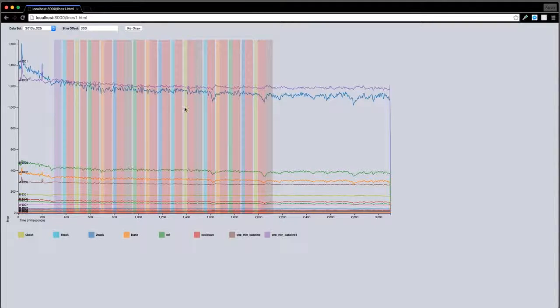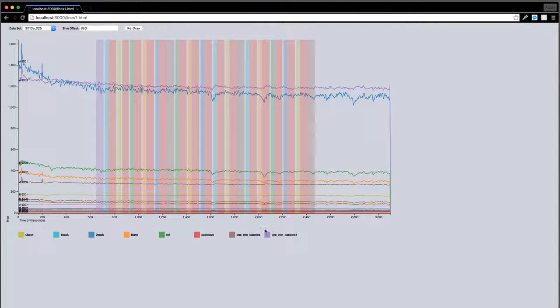And what that allows the user to do is, based on their own information, sync up the two sets of data. So if they know, okay, we put all the equipment on the test subjects, and it took a bit of time to get them going, and about let's say 650 milliseconds in, we actually started the first stimulus activity, which is the 1 minute baseline, they can set that, and so that's where everything started. And during each activity, we can analyze what brain activity happened when. And since I didn't have that actual sync point in the data sets I was working with, I had to build in this extra step in the interface so that the user could select exactly when they wanted the stimulus information to sync up with the brainwaves.